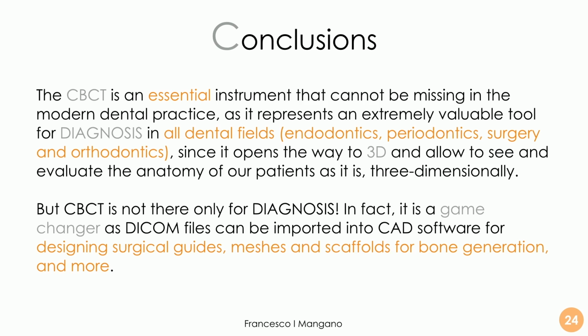So from these very short examples, just a collection of a few cases, we understood properly that cone-beam computed tomography is an essential instrument that cannot be missing in the modern dental practice, as it represents an extremely valuable tool for diagnosis in almost all dental fields. I showed here in this short lecture some perio cases, some surgical cases, some endo cases.